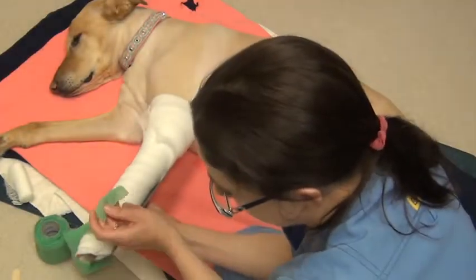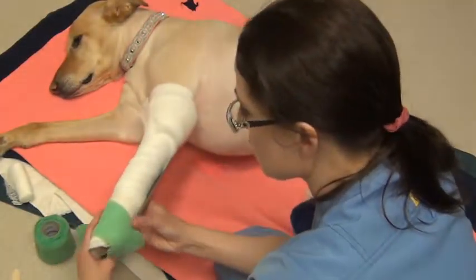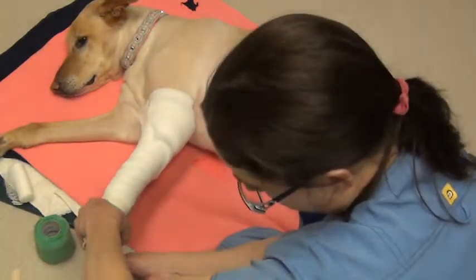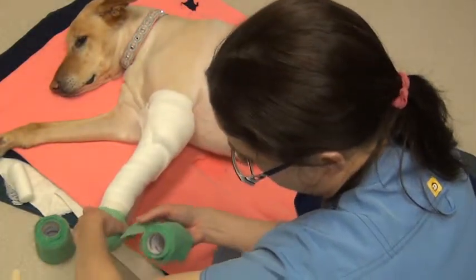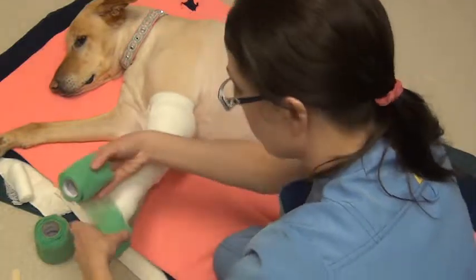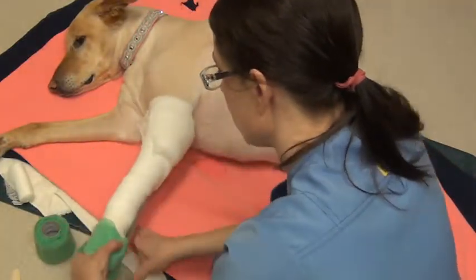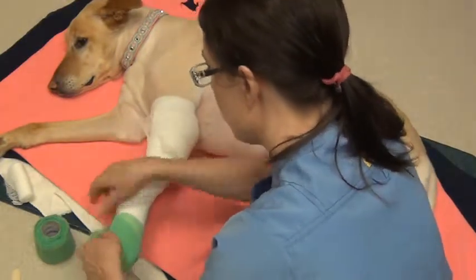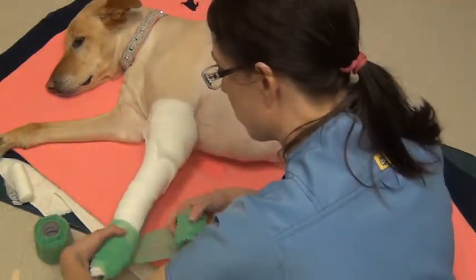I'm going to make sure that I have the metal portion covered on the bottom of the foot. Obviously, you want to leave her toes out. And we will be putting some extra tape on the bottom of the foot there, so we don't have that sticking out. Right, we're going to spiral.